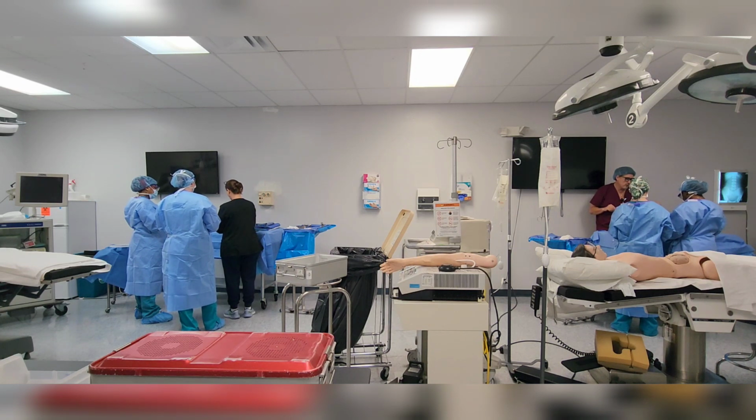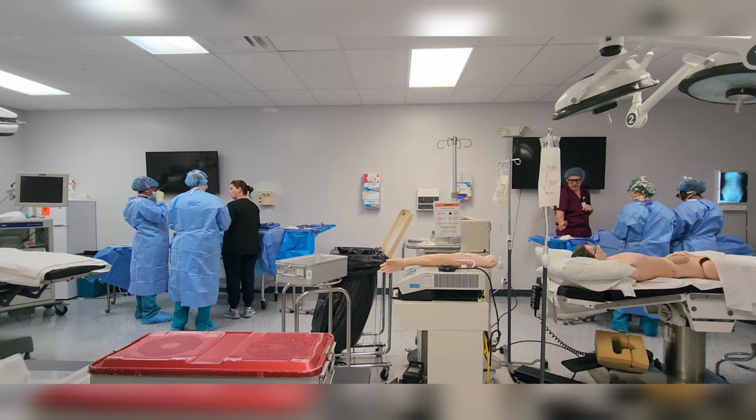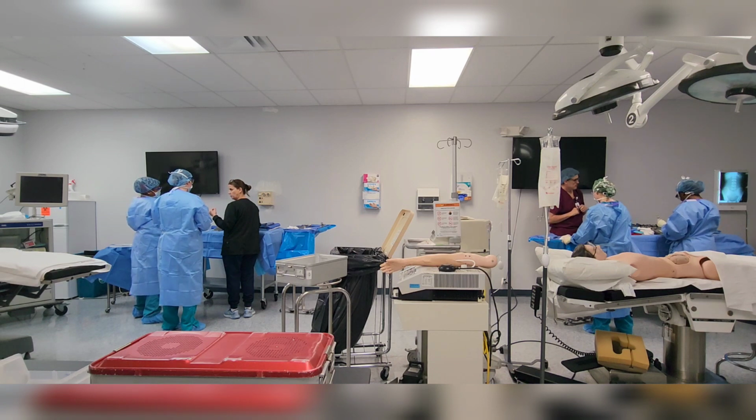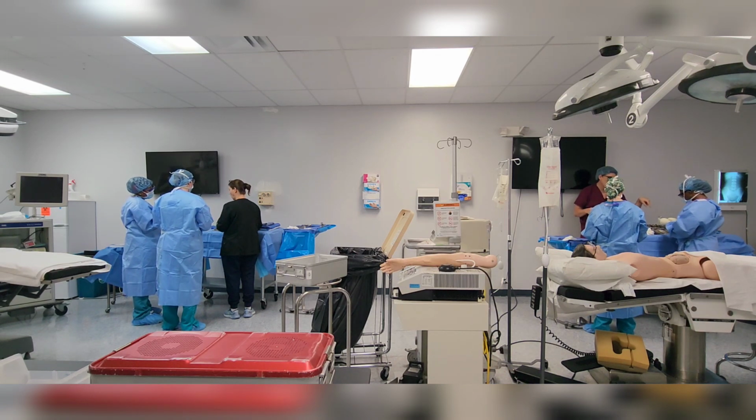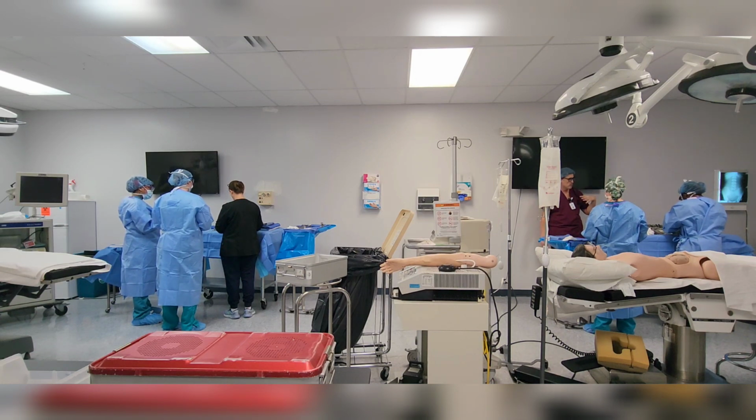So the one other thing I'm gonna show you is to put a towel roll with a clamp right here. In an appendectomy, you might have some oozy things, you might have some blood. So I'm gonna show you how to make sure you're still organized and not trashing as you go along, because otherwise you're just gonna have to re-go.